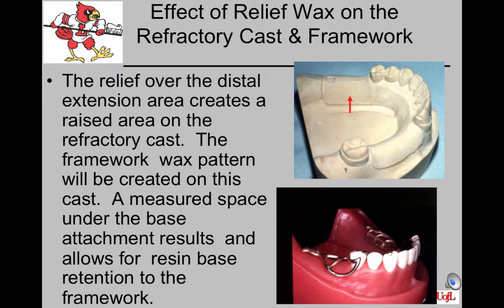The relief over the distal extension area where you have drawn your base attachment creates a raised area on the refractory cast. The framework wax pattern will be created on this refractory cast. On the finished cast framework seen in the lower right, you can see a measured space under the base attachment. This space allows resin to flow under the framework to retain the base and teeth.